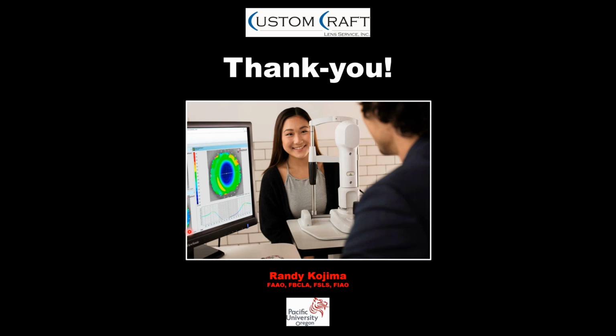Thank you, Randy. Does getting a geometrically centered map make it easier for constructing both an ortho-K as well as a corneal GP, or only an ortho-K lens? I'd say definitely both. Darren, your thoughts on building a conventional GP? I agree with you that it's best for all types of lenses to have that capture to utilize. Really what we want to understand is the topography in relationship to the visible iris.